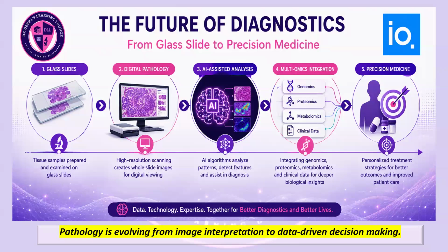So that makes your life so much easier to take a second opinion if the patient is willing for it. Correct? So that is another system that makes access to any other pathologist anywhere in the world to look at your slide. That is a gift. And then we can deliver the clinical care accordingly.